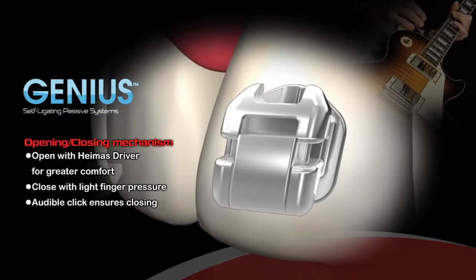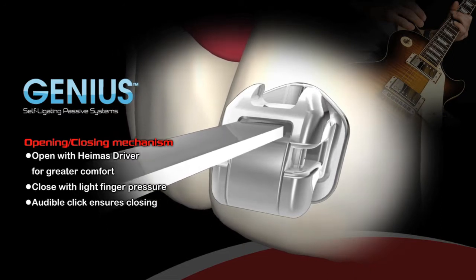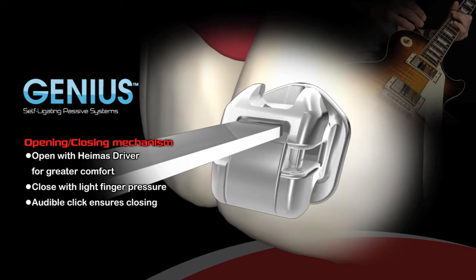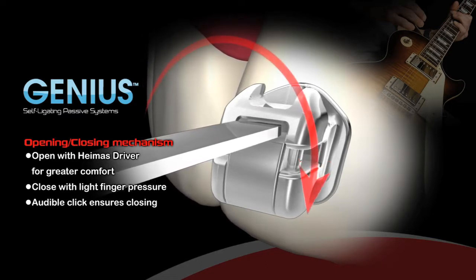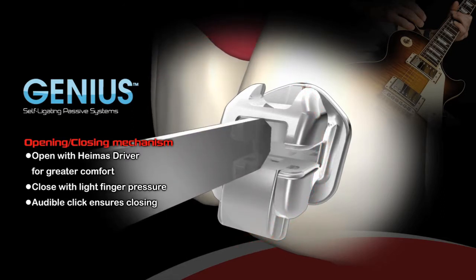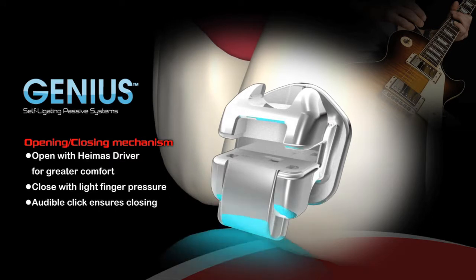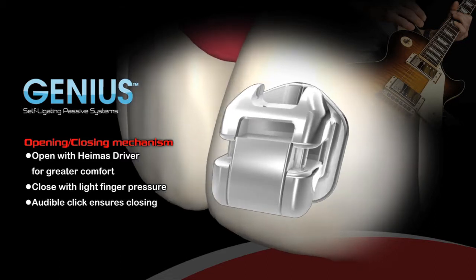Opening and Closing Mechanism: Genius is designed with a powerful locking mechanism that eliminates unwanted openings. No pushing or pulling to open, which could cause patient discomfort. Simply open the gate with a Genius driver, twist 90 degrees in either direction, then close the gate with your fingertip until you hear an audible click. The twist opening method provides great comfort for your patients.